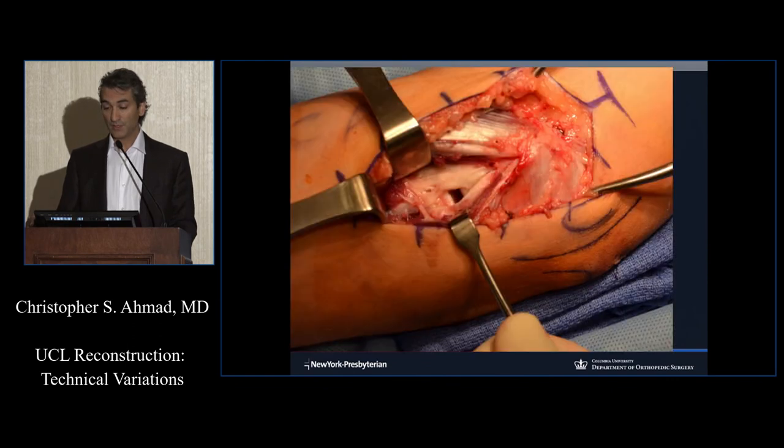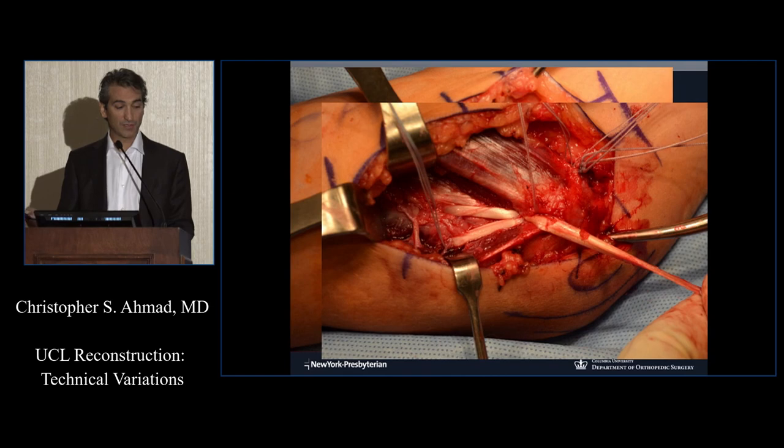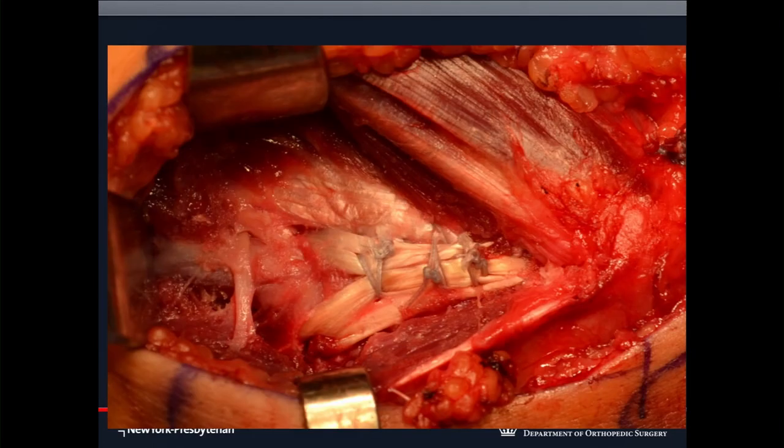I showed you a two-strand graft before. It was two going in. You can do a three-strand graft. You have all this length of ligament. You don't have to remove this. And George, this is his go-to technique. I think Tom mentioned it too, that he used a quadruple strand, and we can talk about their techniques. But you can take this and pass it through the tunnel again. And so you get a three-strand graft. And in fact, the posterior band seems important to me, so I leave extra in the posterior band, because that's the one that's tight when you're in this position. That's the one where you're in a cocking phase.